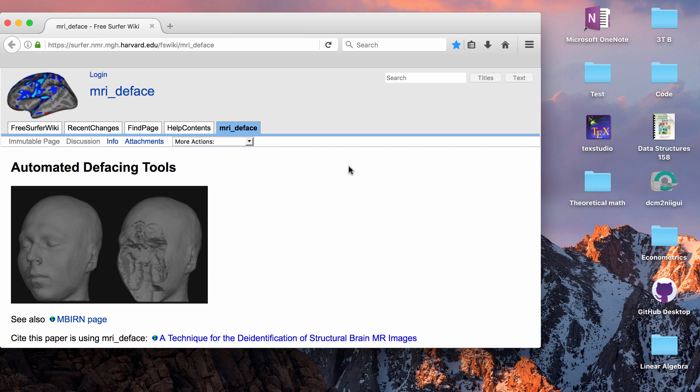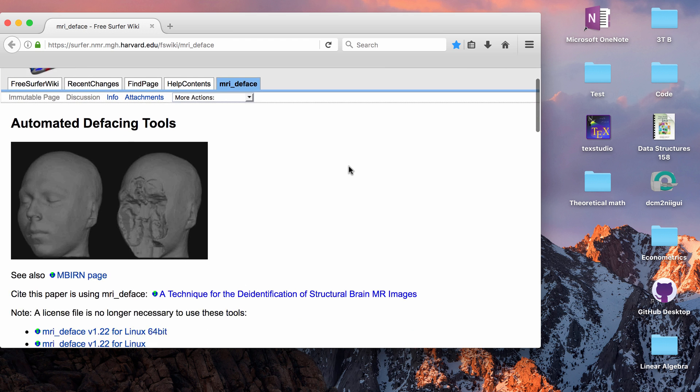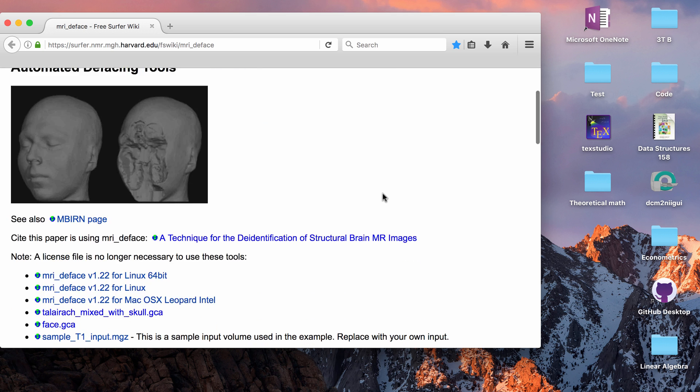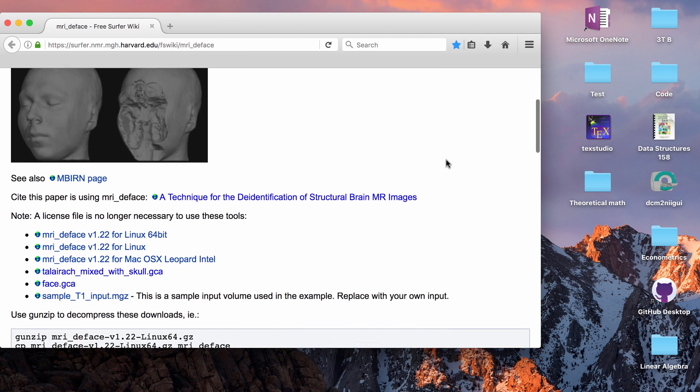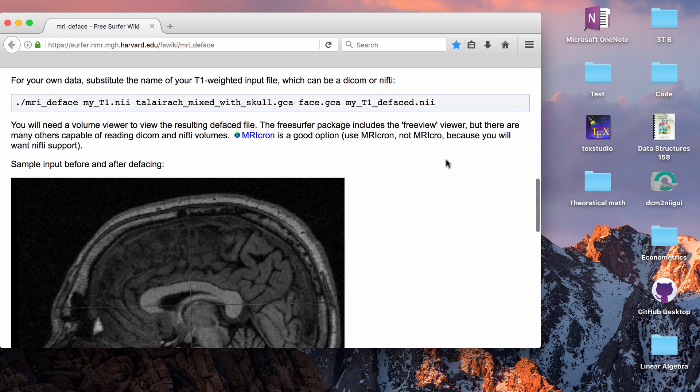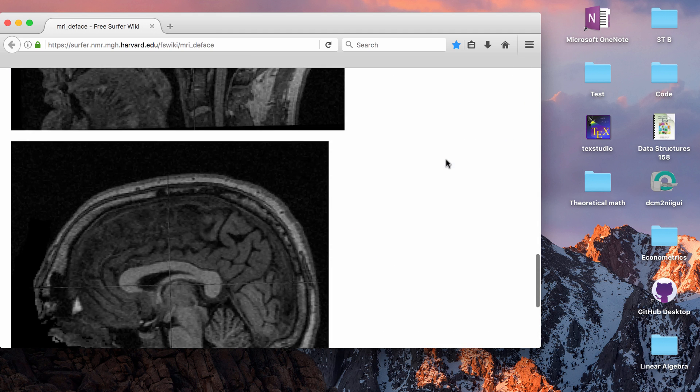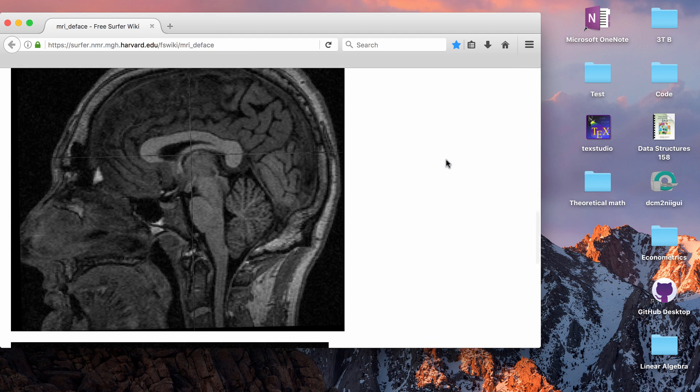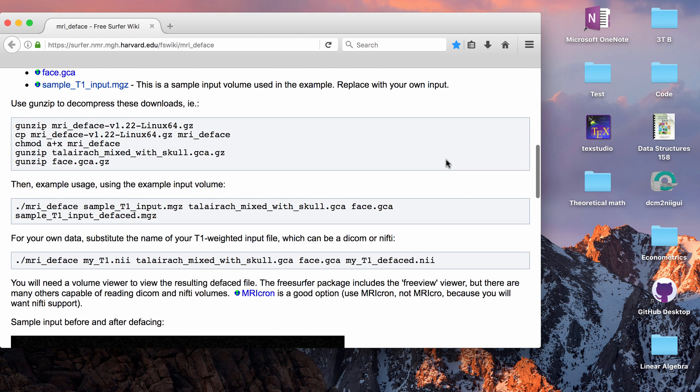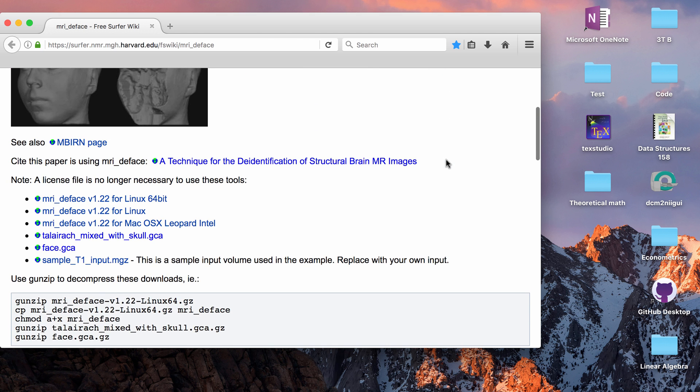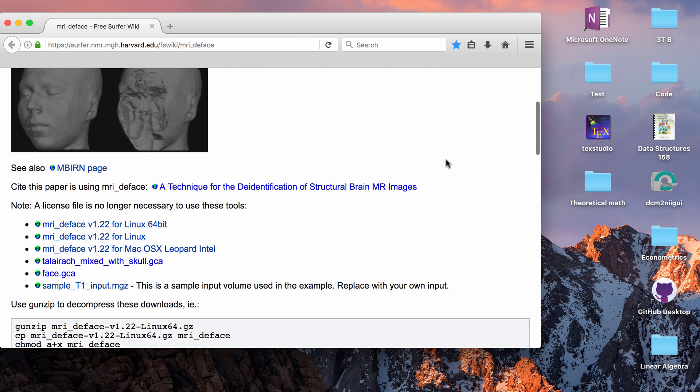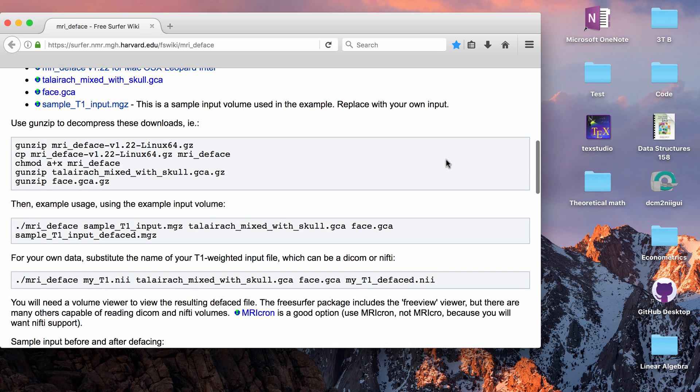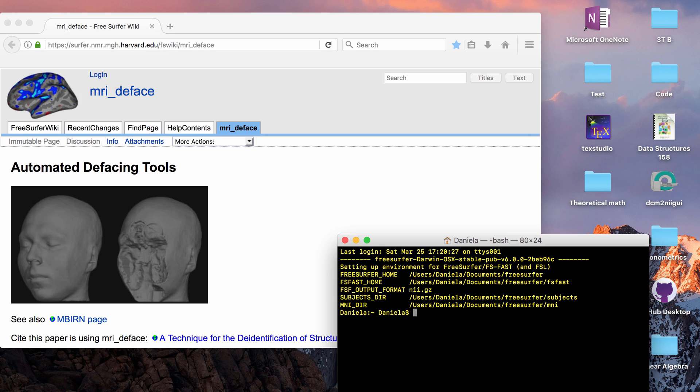There are a lot of different programs that will do defacing of MRI data. FreeSurfer has its own tool, so it's the function MRI underscore deface. So that's the one I'm going to go over in this video. But actually I will show you an example because I ran this a couple times and it didn't actually work that often. So you have to definitely check all the data that you try to deface before you send it to anyone.